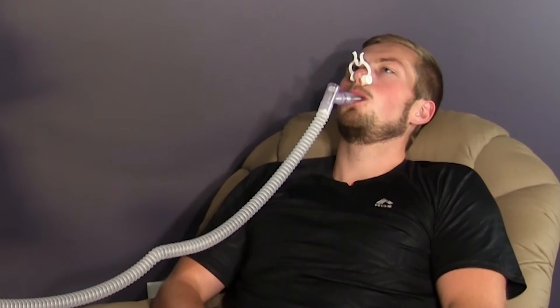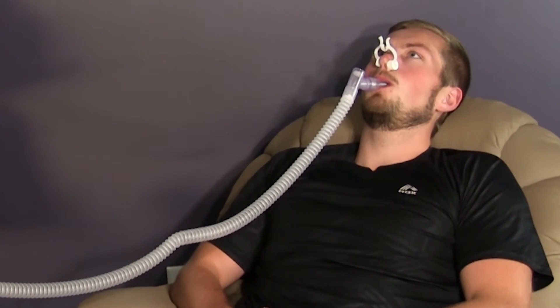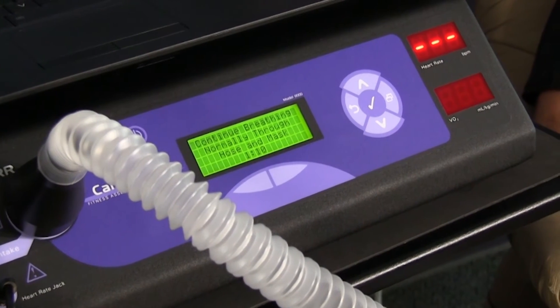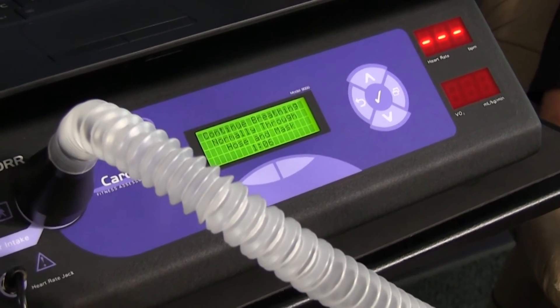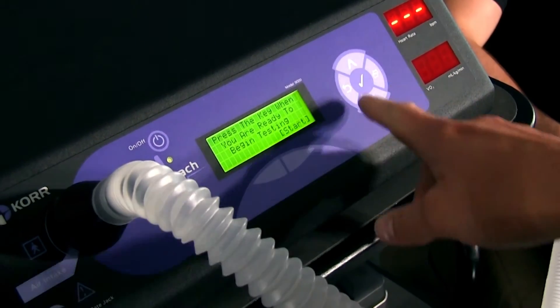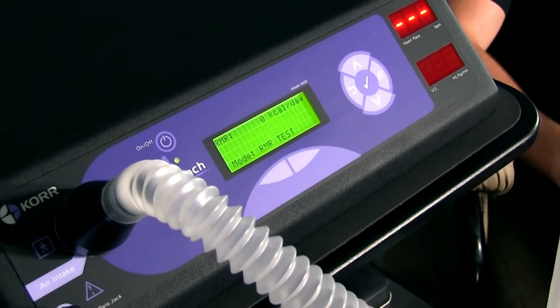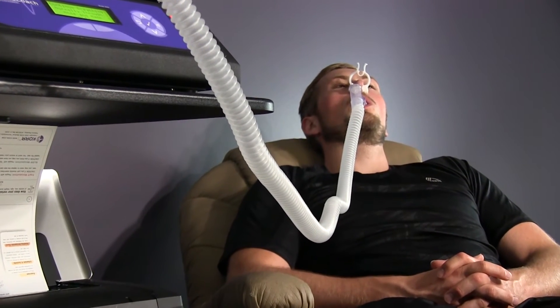Have your client take a few deep breaths. Once the CardioCoach detects a breath, a time clock will appear on the LCD screen counting down from a minute 30. When the countdown is complete, the machine will beep and you'll be ready to start the test. Press the check mark to start the test. Have your client breathe in a relaxed manner.